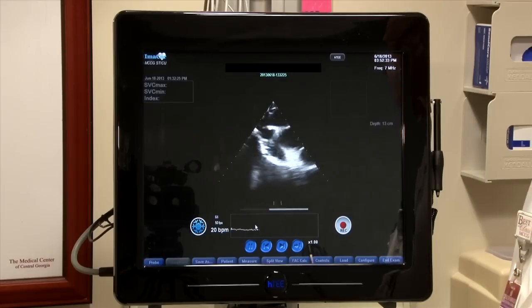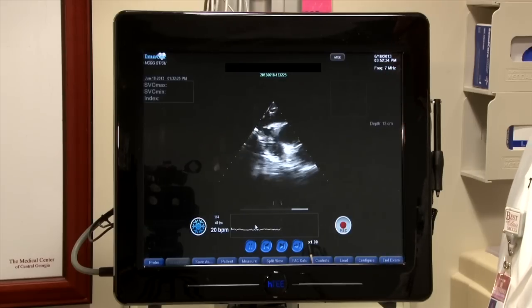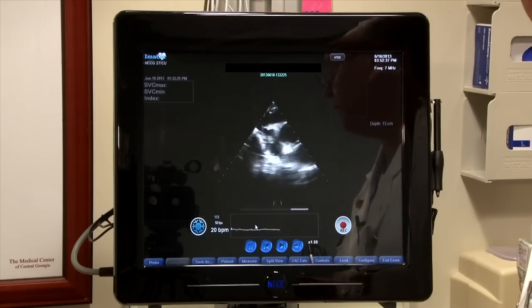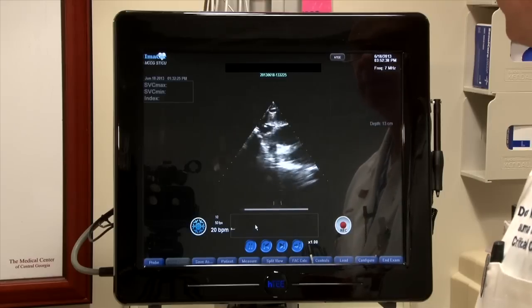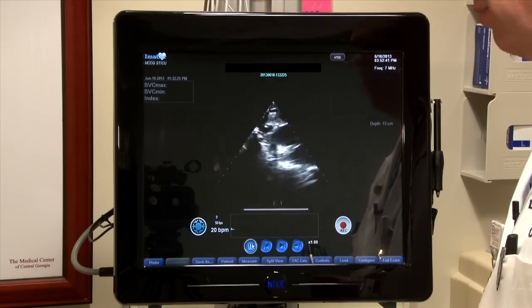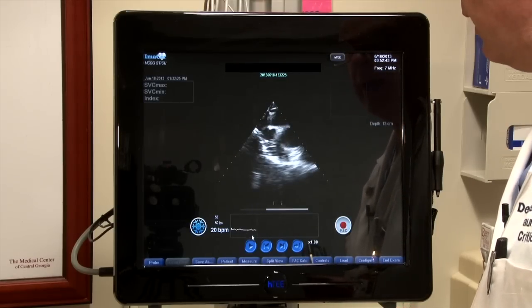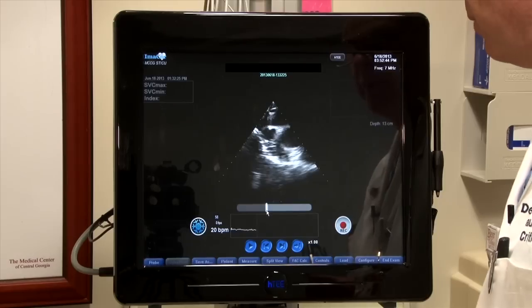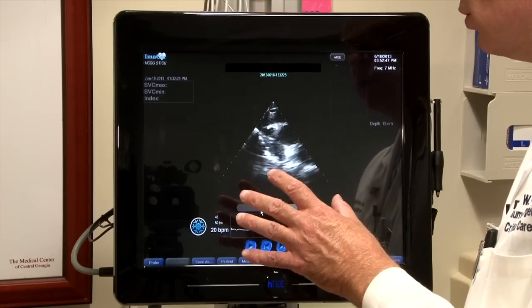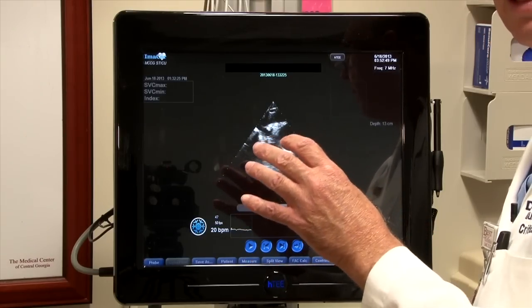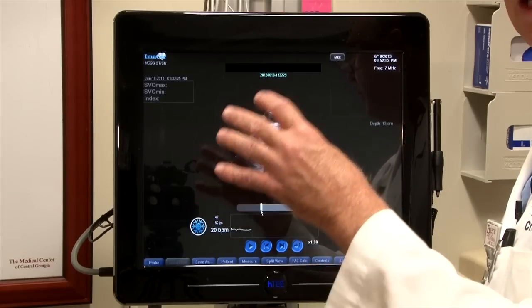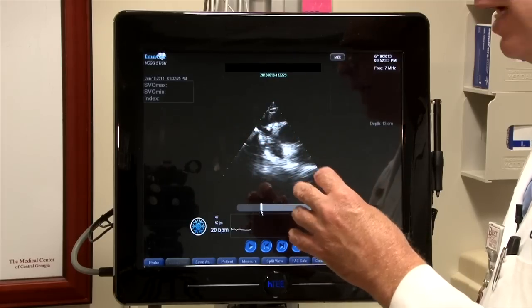Now we're going to measure the SVC collapsibility index. We do that by acquiring our SVC images, and you can see the image is running here. I'm going to pause the image and then come back up to my bar, and now it allows me to scroll slowly through the image where I can see the maximum dilation of the vena cava as well as the minimal dilation.